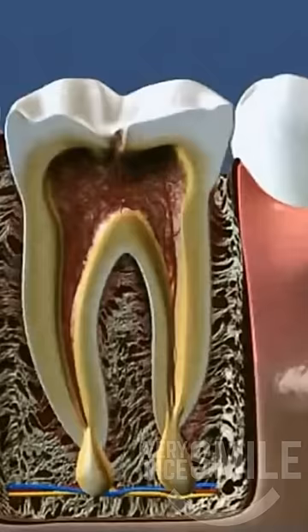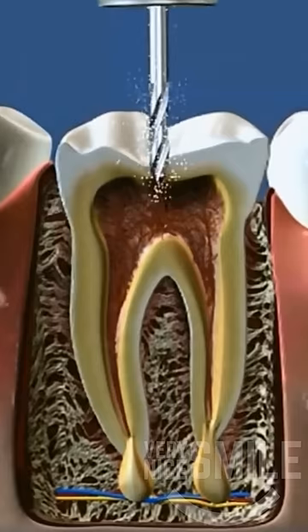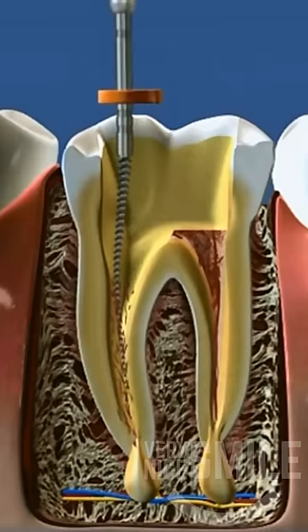To fix that situation, your dentist or endodontist will perform a root canal. They'll drill into the tooth and then, using thin endodontic files, remove all the diseased nerve tissue that's inside the tooth.